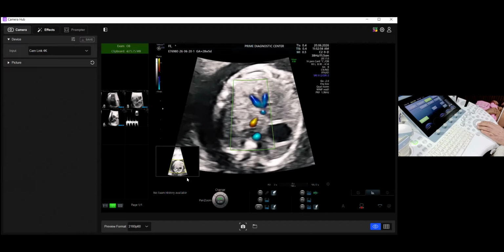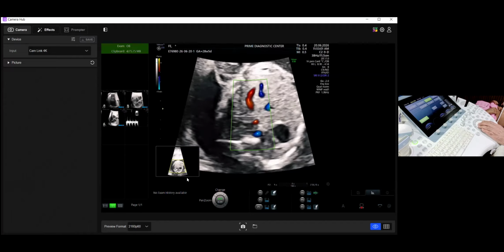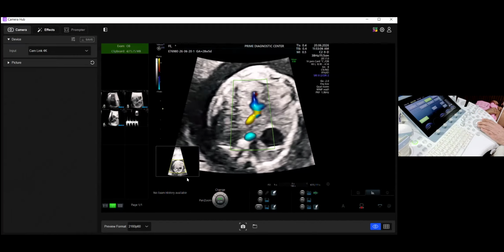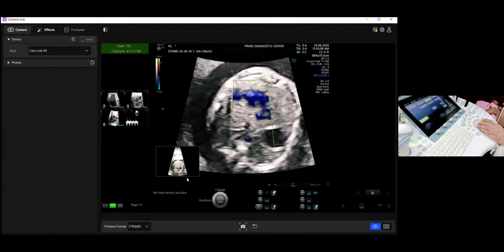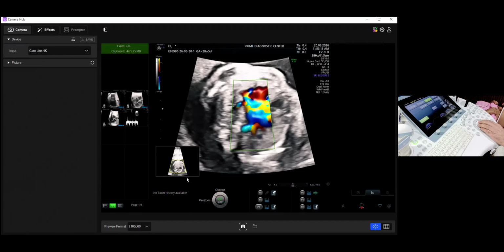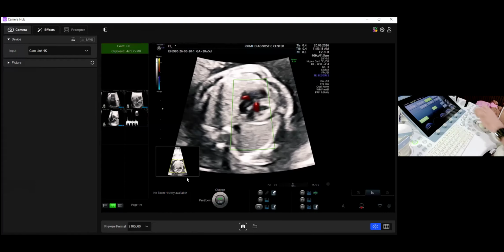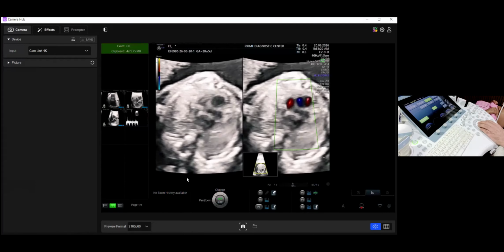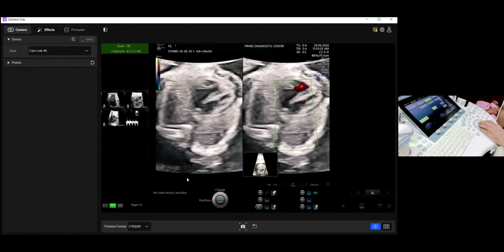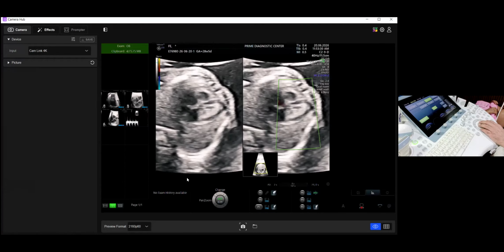You see the aorta on the left. You see the stomach on the left. And this is anti-clockwise, right? So I expect the head to be up. So I move the probe up and there I see the heart and I'm happy. With low flow, you can see the pulmonary vein entering, but I'm more interested in a four chamber view. So we go side by side always, and then you get a four chamber view, a little lateral.